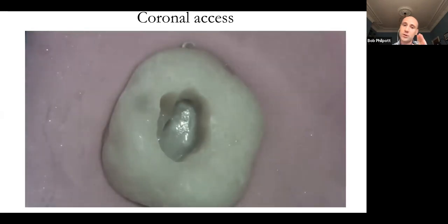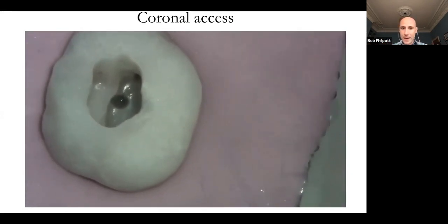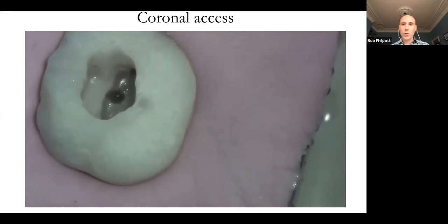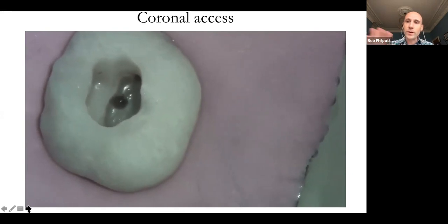A little bit more air, and I'll just tilt it again now in a second, just for you to see where it is. And you can see quite obviously an MB2 nicely opened up. You can see its relation to the MB1 a couple of millimeters away. And so it's the mystique associated with it. We need to get rid of that.